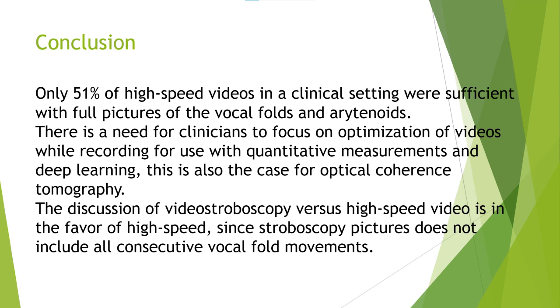The discussion of video stroboscopy versus high-speed video is in favor of high-speed, since stroboscopy pictures do not include all consecutive vocal fold movements.